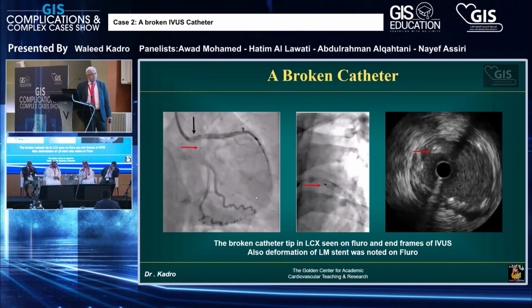Sure. So just to clarify, the dots you showed us in the LAD, right? No, this is the dot in the circumflex. Okay, in the middle one, this is the LAD or the LCX? No, this is that's a fluoro, an epicardial that's overlapping. Okay. This is the stent and the LAD. But this is the dot that I showed you in the caudal view. This is the dot in the circumflex. So clear. So you have a broken segment of your catheter in the LCX with no wires across it or beside it. Yeah. Thank you.